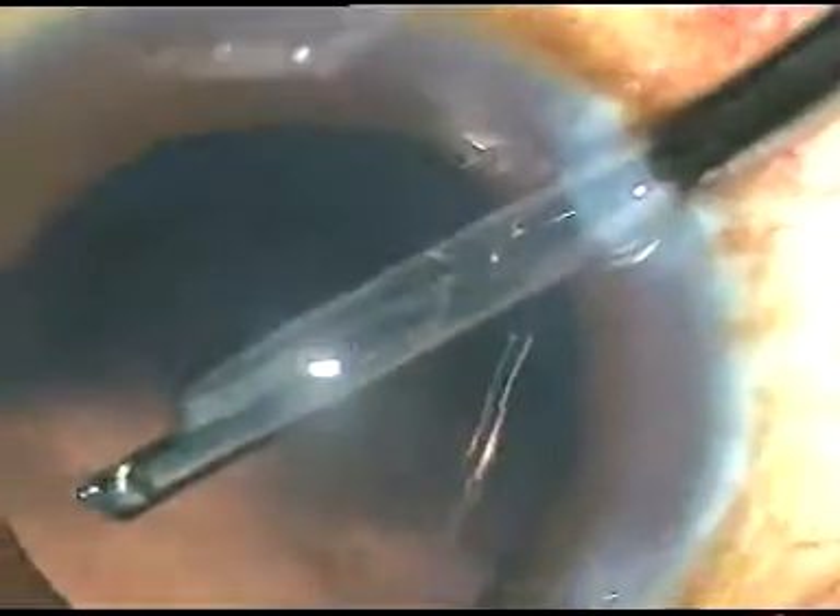By this time, cortical cleanup has been done. Now a little bit of polishing of the posterior capsule is being done.